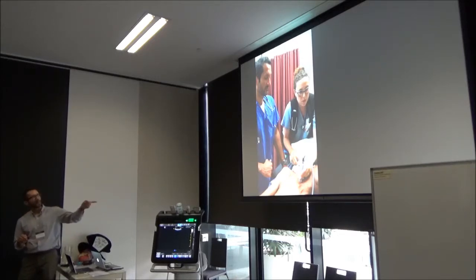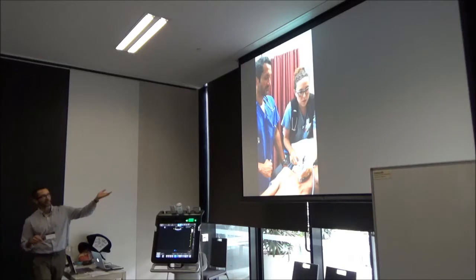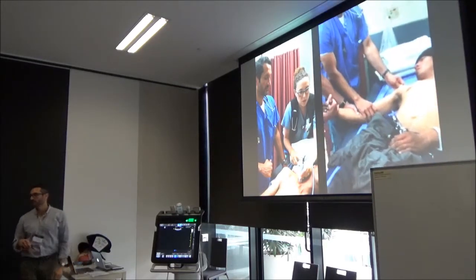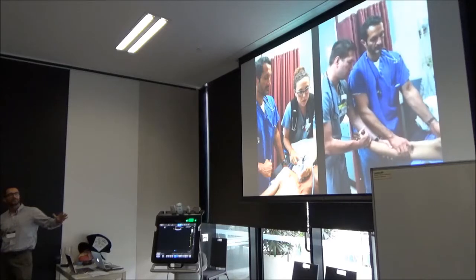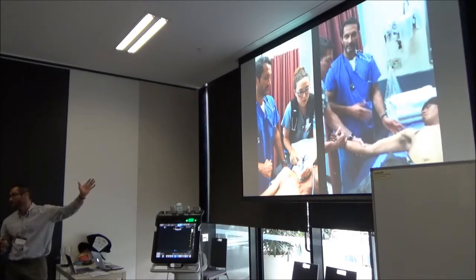So again, this is my resident popping it in. And what's nice about this in the training program, you can get one of your residents through the procedure, and then you can walk your med student through a nice simple reduction while the patient's wide awake, and you're teaching them how to slowly pop the shoulder in. And it already pops in, he's comfortable, the patient's happy, and you can move on. It's a nice way to teach both parties how to do this.